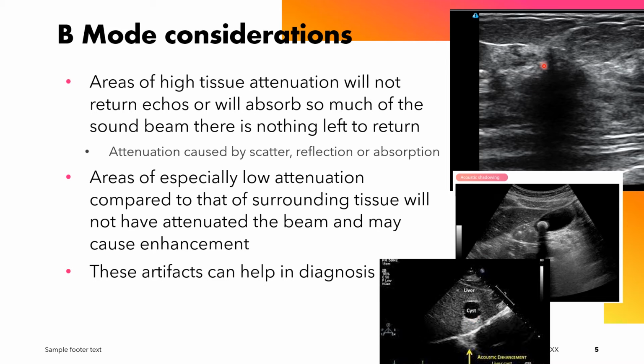However, if we come up here, it's quite the opposite. Here we have something that looks just like relatively regular echogenicity, and yet it's producing a large shadow. That tells me that this particular area has some high attenuation qualities that I'm not seeing anywhere else, which would cause a reason for concern. And then the same thing can help us identify these gallstones and watch and make sure that they are mobile and help us really determine that they are truly gallstones and not some polyp or other differential diagnosis.